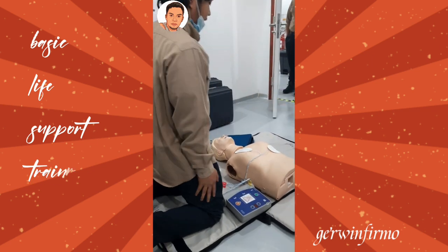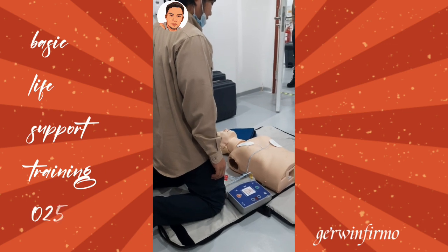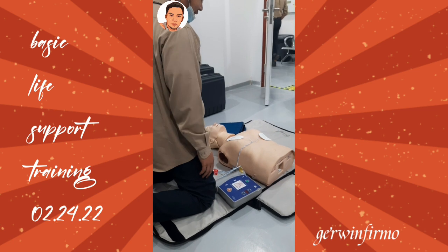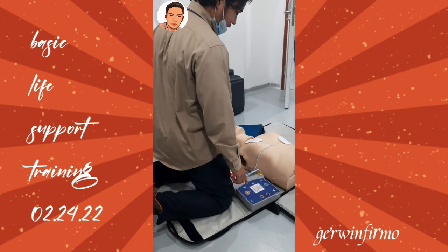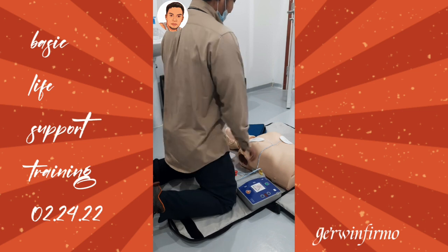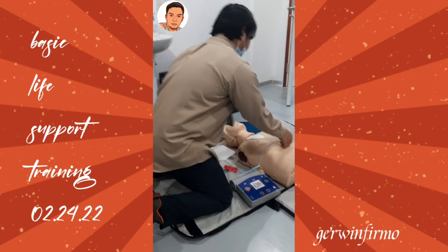Do not touch the patient. Shock advised. Clear. Everybody's clear. Charging. Stay clear of patient. Clear. Deliver shock now. Press shock. Shock delivered. Pause. Begin CPR.